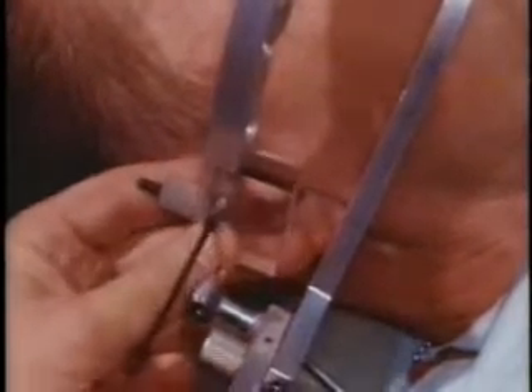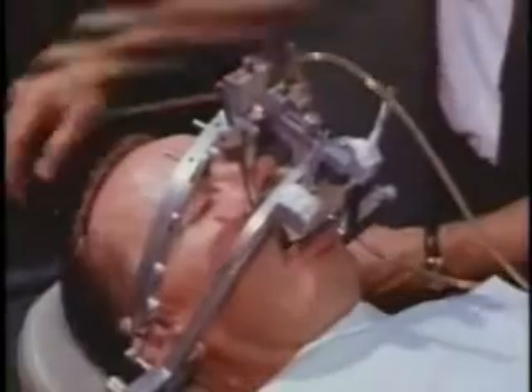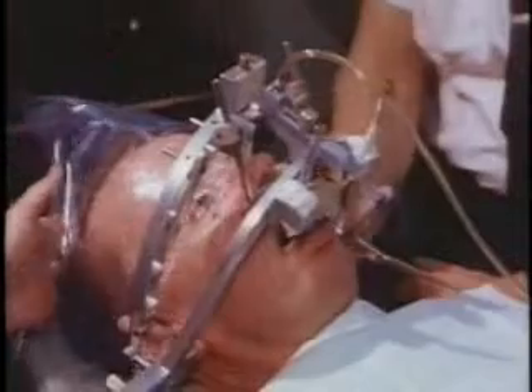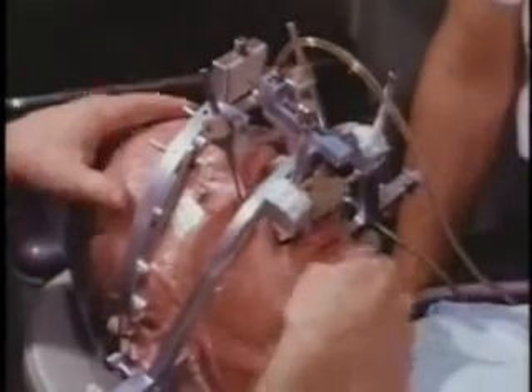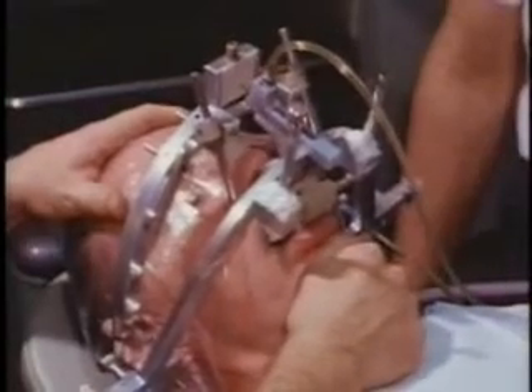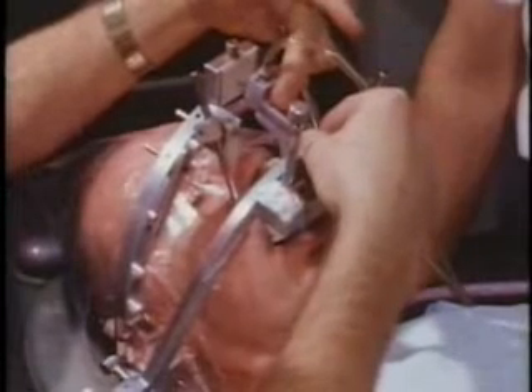The drills are again retracted so that the alignment blocks may be removed and replaced with recording blanks. A clear plastic shield is placed over the patient's face to protect him from the resin particles generated by the drills. The subject is rehearsed in the various movements to be recorded. With the mandible in centric relation, the anterior drill is activated and inserted into its recording block.